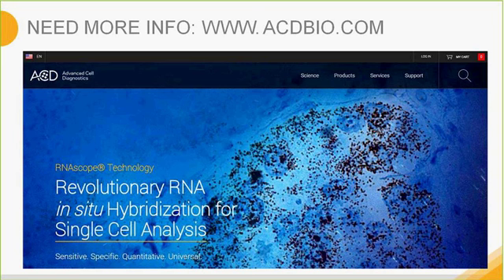One question is, are there any pretreatment recommendations as far as the new 2.5 versus 2.0? To answer this question, this really does depend on the tissue types. So we do recommend that you start out with our standard pretreatment conditions.